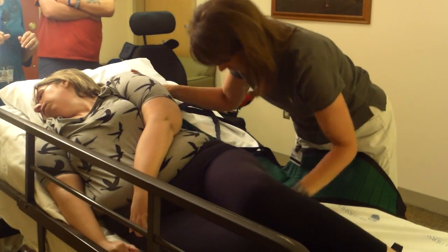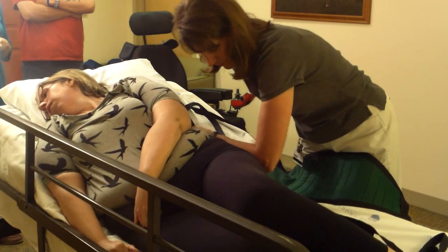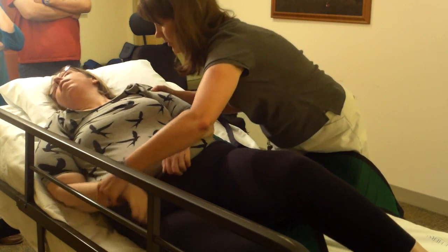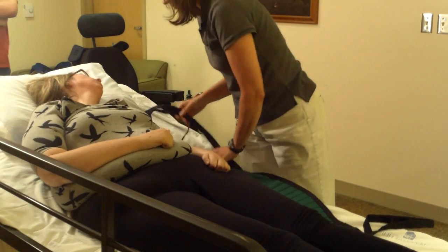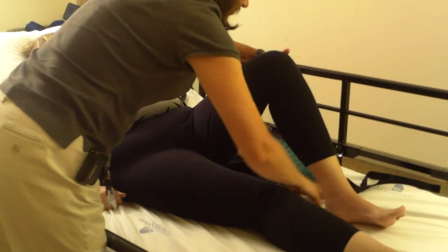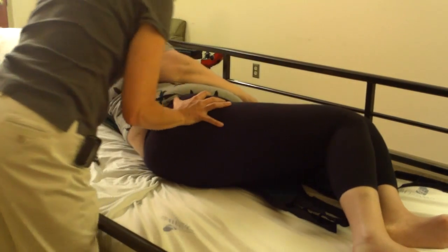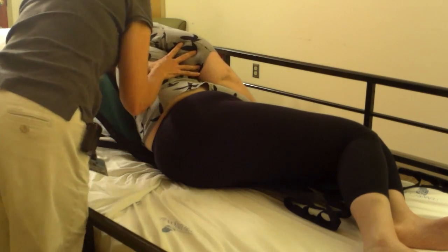Make sure the upper half of the sling is rolled and tucked underneath so that when she is rolled back, the other part can be positioned under the right side of her body. At this point, put bed rails up just to help with extra support. You will now bend the knees, reposition the arms, and roll her onto her left side so that you can pull through the rest of the sling.